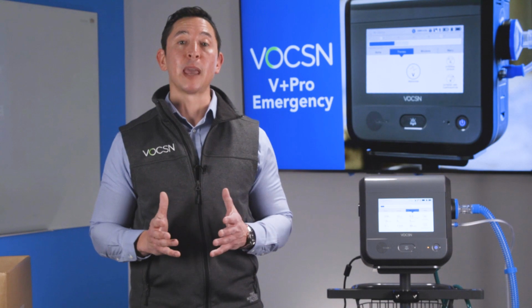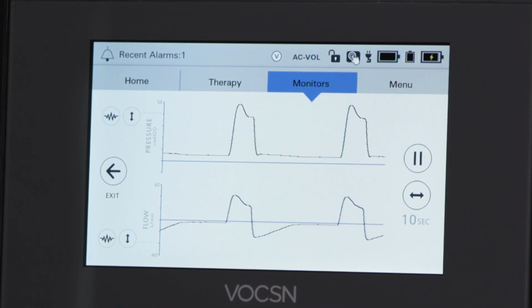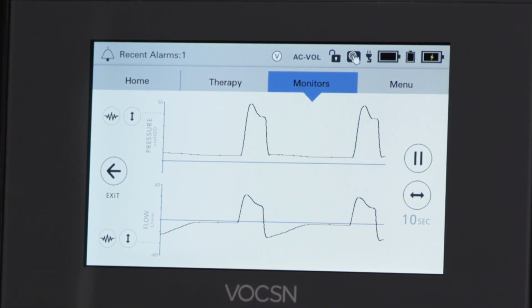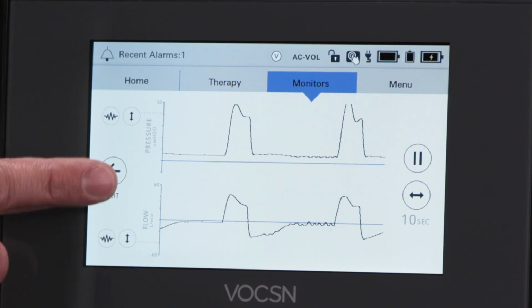VOCSN also has the capability to monitor waveforms. So I can simply touch the waveform icon right there, and we can display 2 waveforms. Right now I'm showing a pressure waveform and a flow waveform. We could also display a volume waveform as well. We can exit back out.